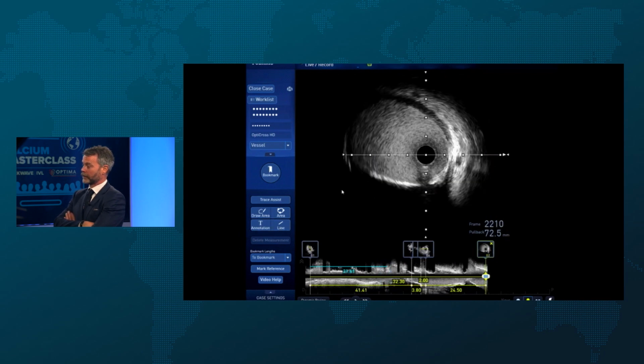It's pretty big. As is often the case, it's ovoid, so it's probably back here somewhere, I guess.